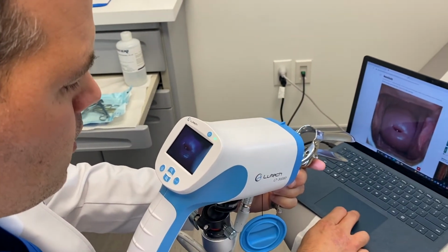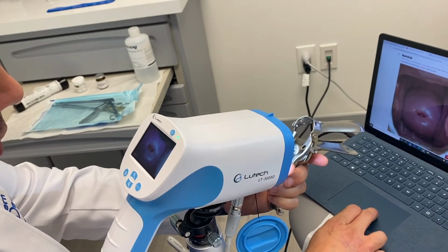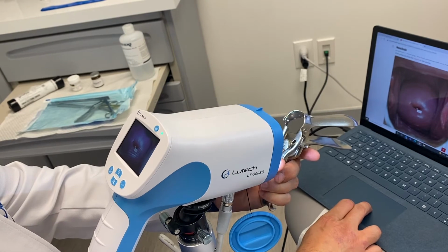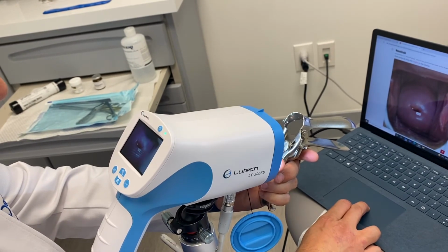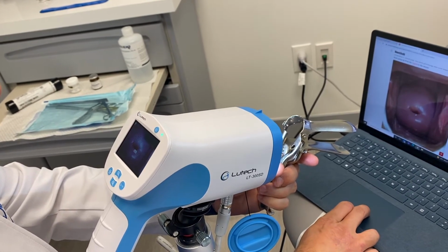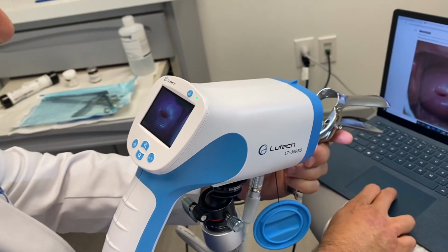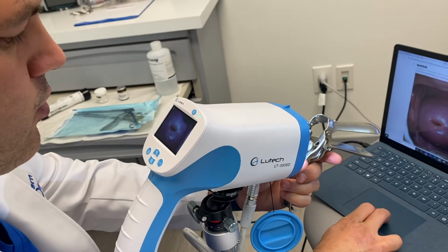The endocervix will be the inside of the cervix. We usually do something called an ECC, which stands for endocervical curettage, which would allow us to sample the inside of the cervix, and with the biopsy we will usually sample the ectocervix, which is the outside of the cervix.